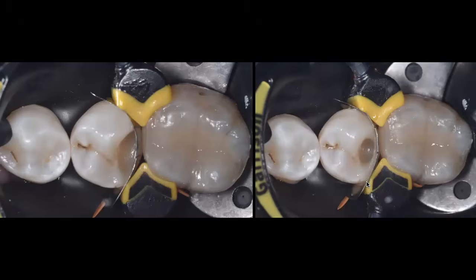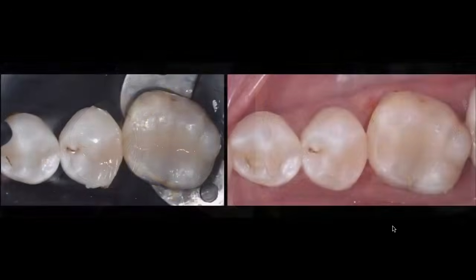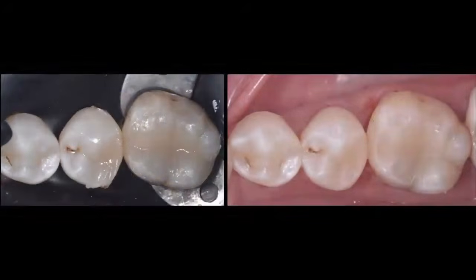Then after the brush, I use a micro brush with a little bit of adhesive. And again, just push, adapt, make sure that everything is in contact so that I then can go ahead and light cure and then do my final horizontal layer, my buccal, my lingual layers. And you can see now I've completed the second restoration.